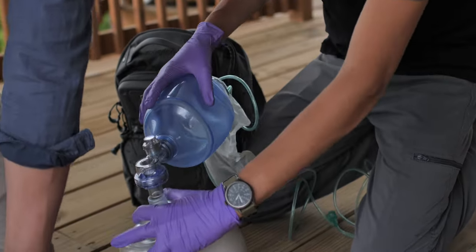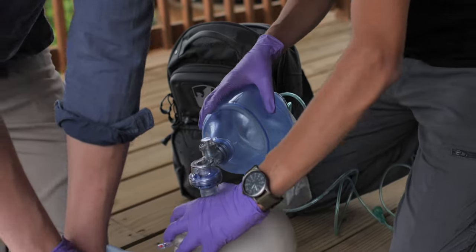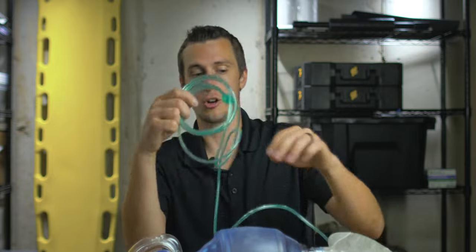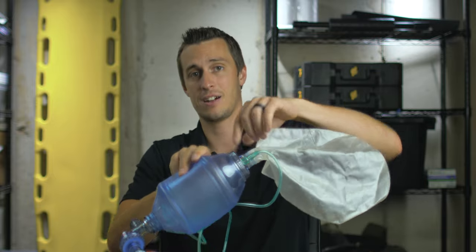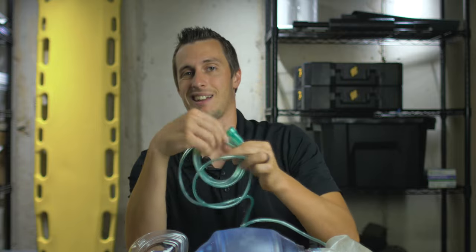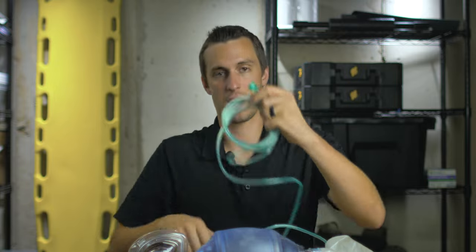This can be used on room air, since our ambient air around us has 21% oxygen. Or, if there's oxygen available, we can take the hose connected to the back of the BVM and connect it to an oxygen tank to provide about 95 to 100% oxygen to the patient as we're ventilating them.